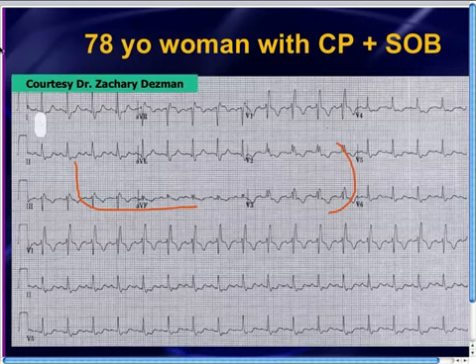Anytime you read an EKG as inferior and anteroseptal ischemia because of flipped T waves in those leads, that patient has acute pulmonary hypertension, if those are new findings. And in emergency medicine, acute pulmonary hypertension, new pulmonary hypertension, equals pulmonary embolism until proven otherwise. And chances are it's a big one.